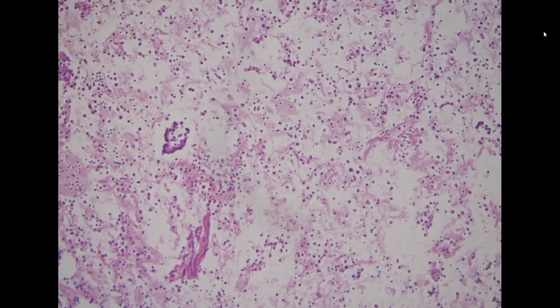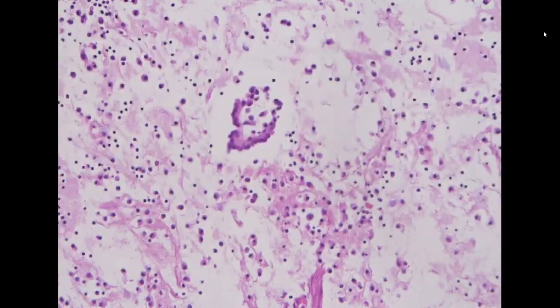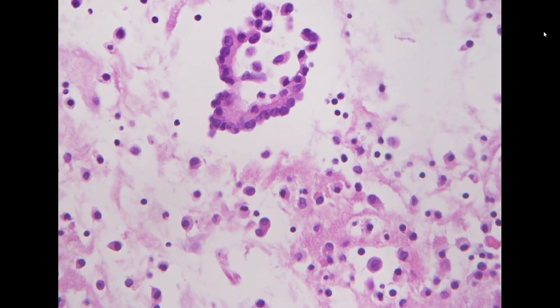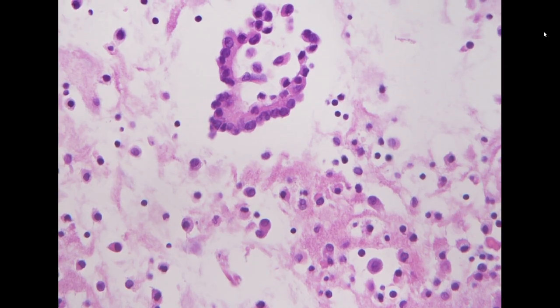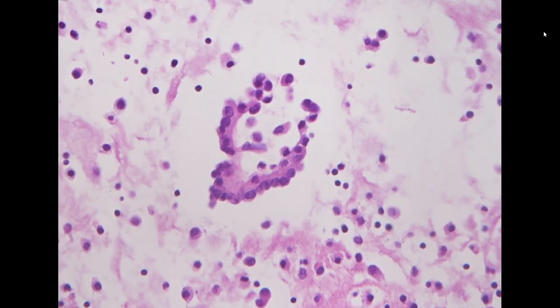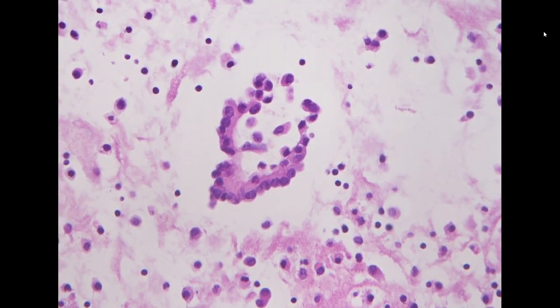So if we go to the cell block, there are definitely some cell clusters showing these glandular features, but you have to be aware of that. Reactive mesothelial cells usually don't form a cluster. However, if the patient has received surgery, or we see some procedure, for example, like a pigtail or something like that, sometimes it can have mesothelial clusters floating in the body fluid specimen. So this is another thing that you need to be aware of.